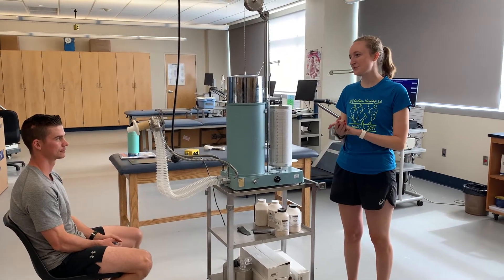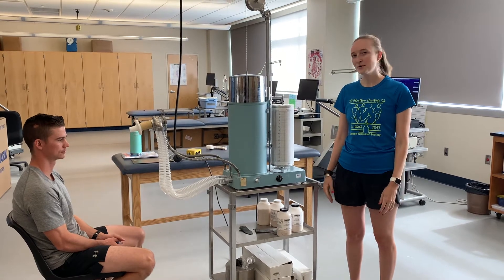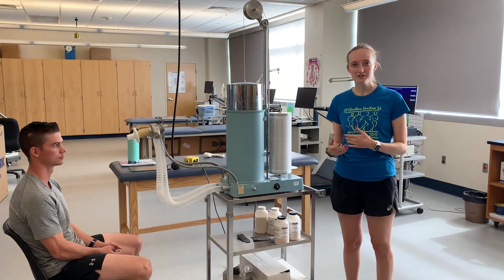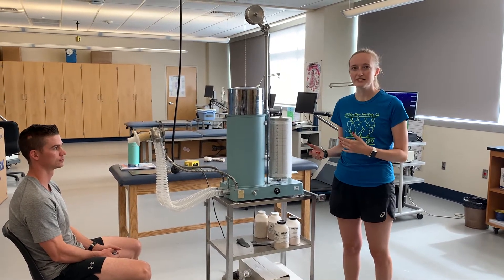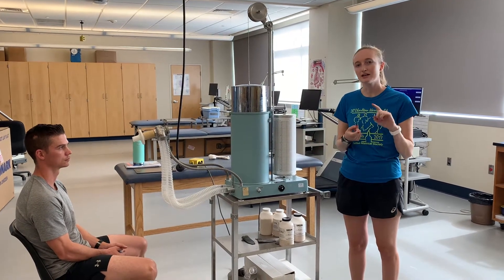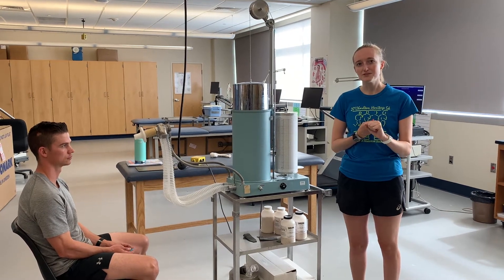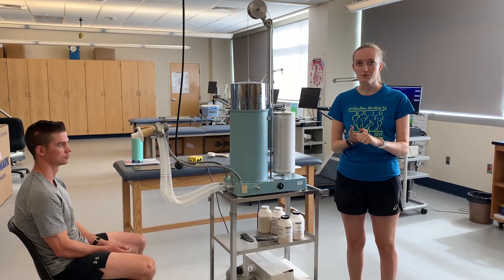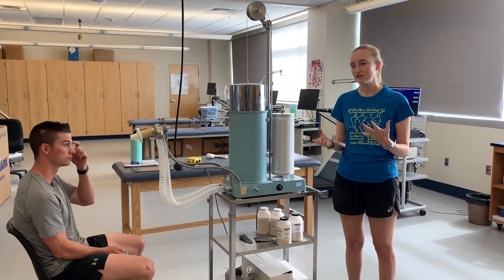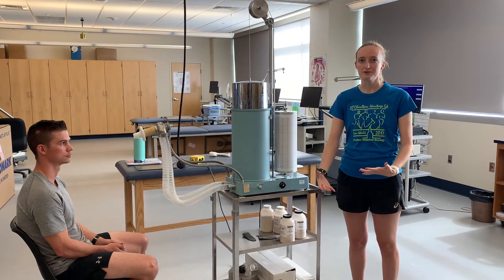Today we're going to be doing pulmonary function testing on our subject Ethan. Pulmonary function testing is really good for looking at an individual's lung function. We have our bell spirometer here, which is how we're going to be measuring our forced vital capacity (FVC) and our forced expiratory volume in one second (FEV1), as well as our FEV1 over FVC ratio.